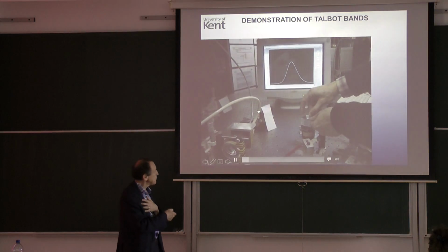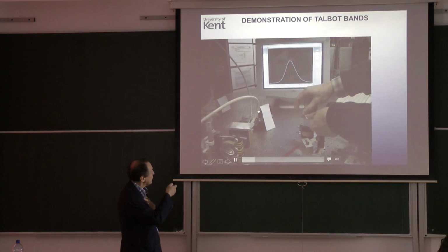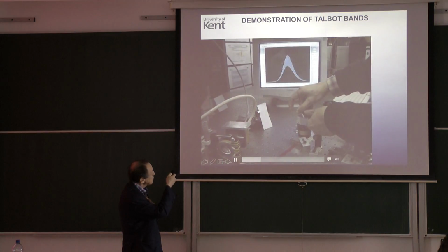So I introduce the glass plate and look at the spectrum. You see that Gaussian spectrum? The modulation.